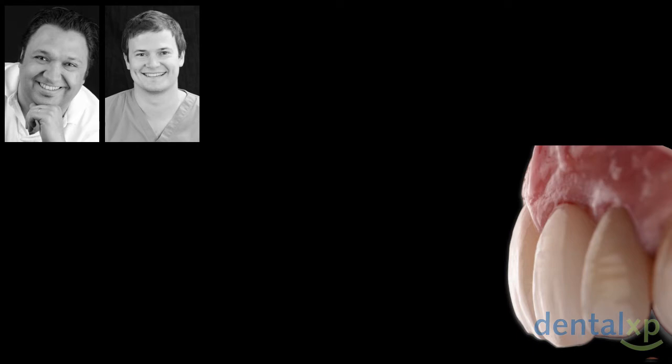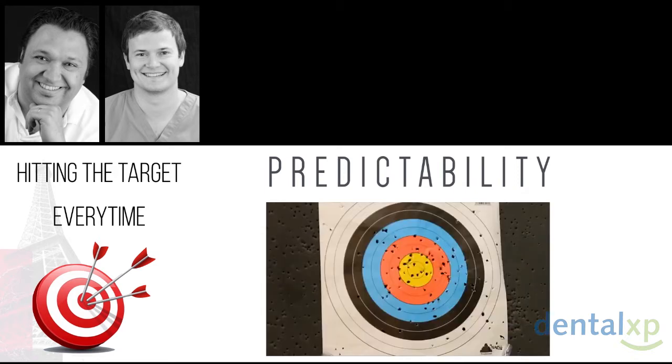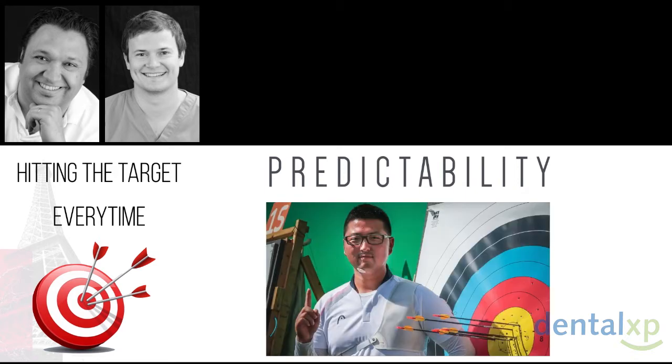And I want you to consider guided surgery just as an additional tool to enhance your daily practice, to make you more predictable in your everyday practice. So to take another example about precision, if you're in a good mood or if you have good skills, it could be easy for you to reach the center of the target, but for one shot. But you can see that if you try again and again and again, it will become more difficult for you to put the arrow in the same position.